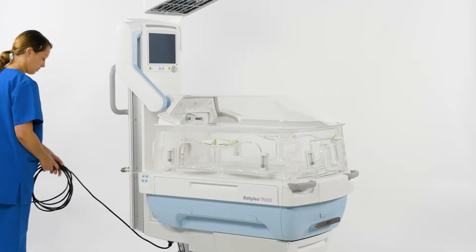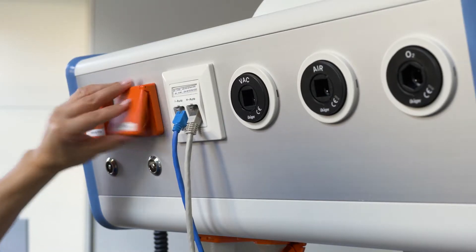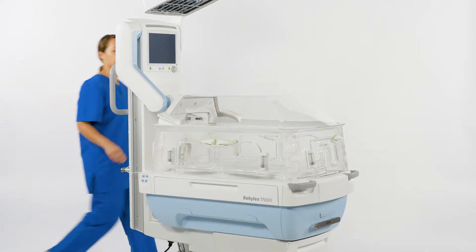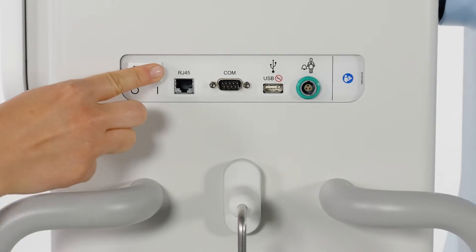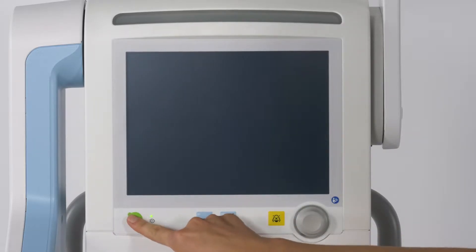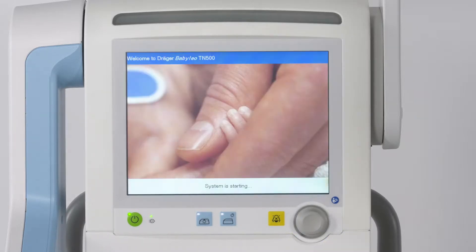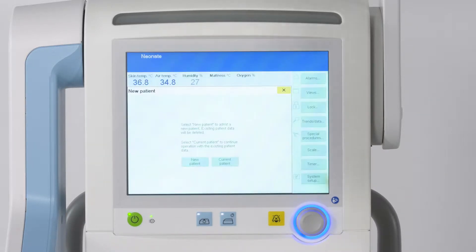Plug the device to the mains plug. You will find the main switch on the rear of the main column. Wait 7 seconds, then press the Start-Standby key. Your device is now ready to operate.